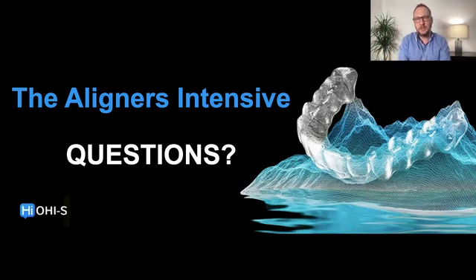In the rest position, I can check whether I can extrude or intrude, because if the patient already shows their incisal edges in rest, I cannot extrude more, and sometimes they are not showing anything, so I cannot intrude. So with these 2 photos, I'm doing the vertical diagnosis, okay?